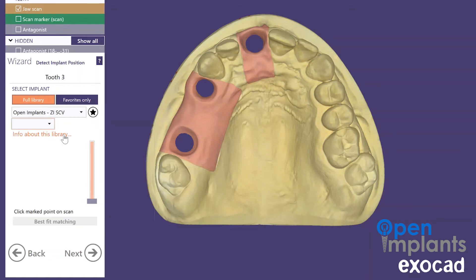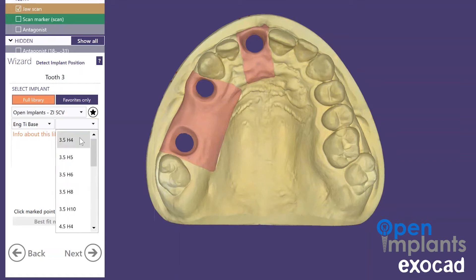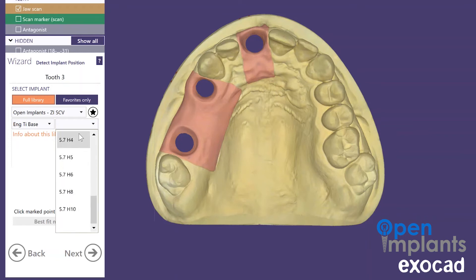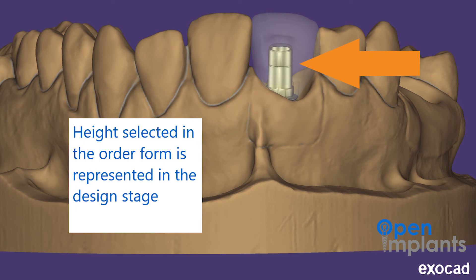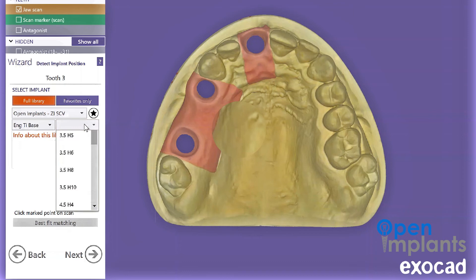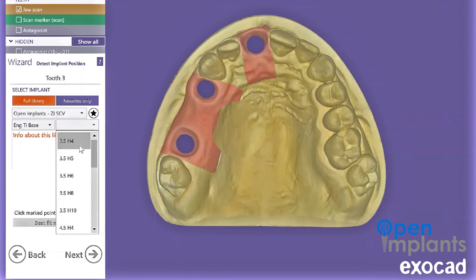We're going to select the engaging titanium base. The next step is to select the height. Make sure that the size and height match — that's super important. This might require a little bit of pre-planning on your part, as you are selecting the final height at this step. So if you have a 10mm ti-base and you wanted to use a 6mm ti-base, that's the selection that you're going to pick.